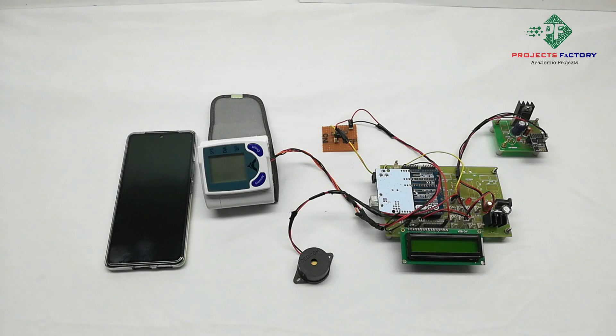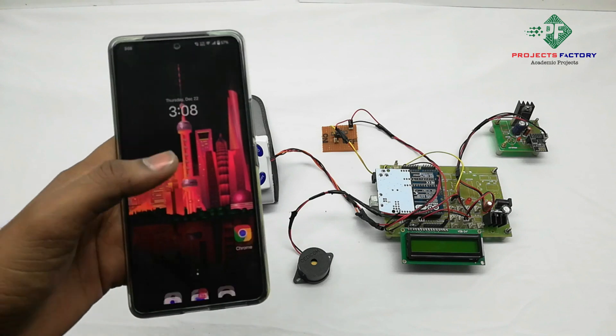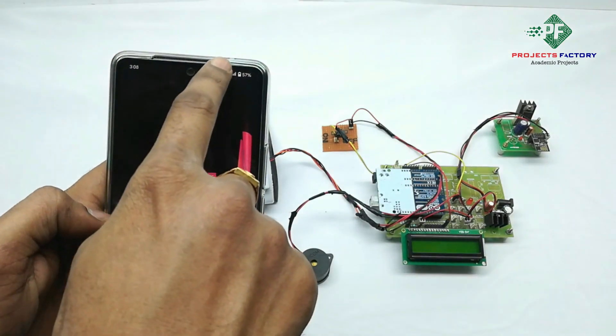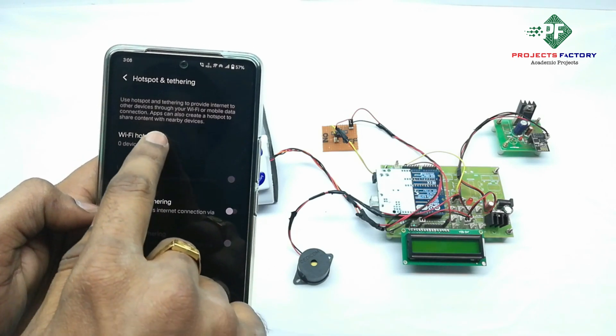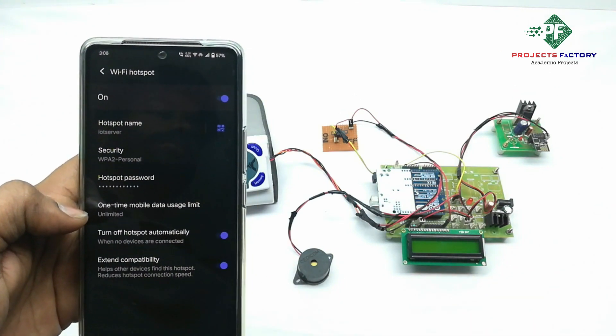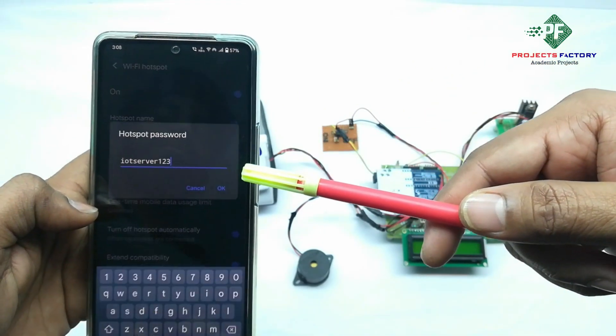Before starting this project, we initially have to create a hotspot on our mobile with username 'IoT server' and password 'IoT server123'. Now we open the hotspot settings — you can see the hotspot name 'IoT server' and password 'IoT server123'.